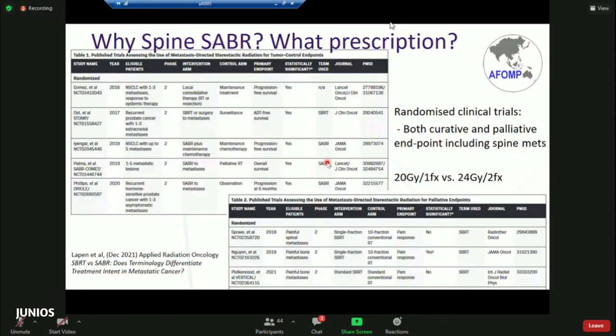So why SABR? Probably you don't need to memorize all those. This will be shared with you, but the primary purpose of this talk is about sharing our clinical evidence. It will be helpful for those of you who are doing liver and spine SABR. Typically we're talking about two fractionations, 20 gray in single or 24 gray in two fractions. The number of randomized clinical trials is flooding in. So the whole take home message is that SABR is being used for curative intent in metastatic disease or for palliative purposes, and there is some evidence coming in.